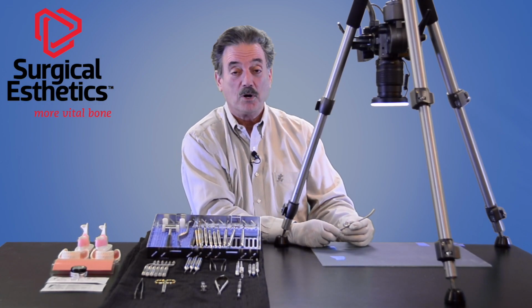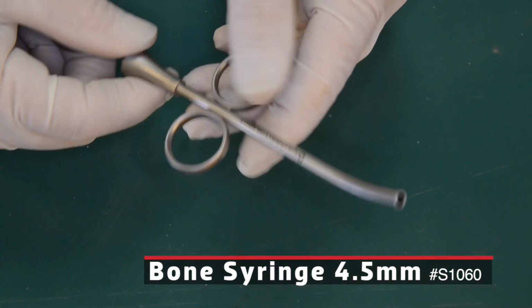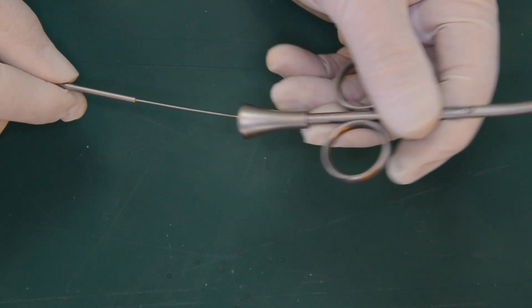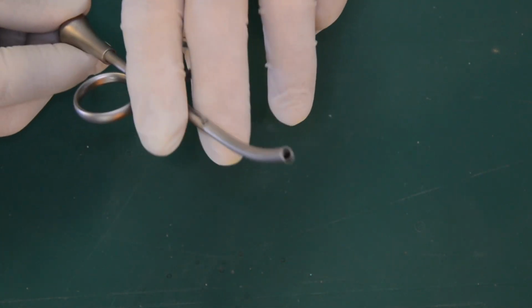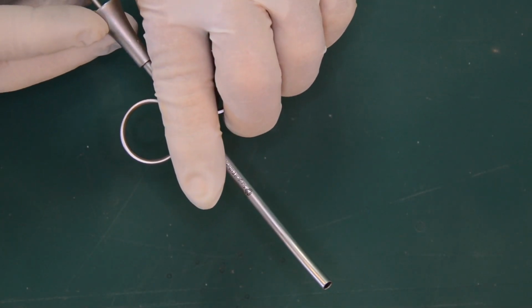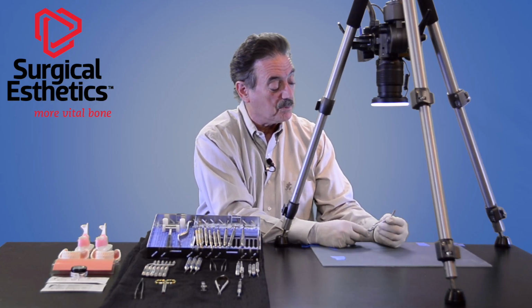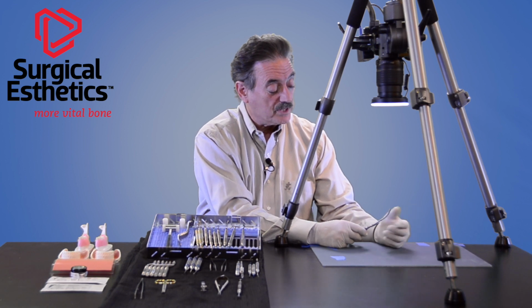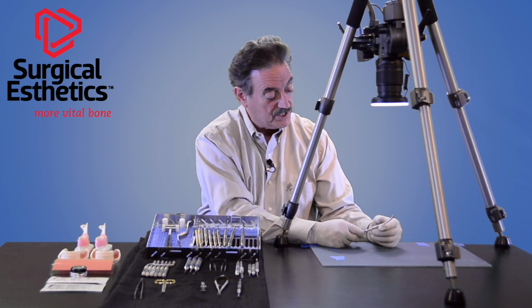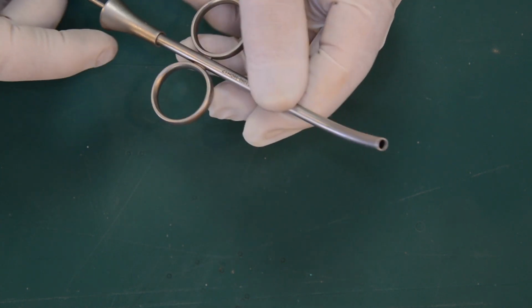Okay, the next instrument is the bone syringe. The bone syringe is really effective and works kind of like an amalgam delivery instrument, although we always load it from the tip. Never try to load it from the back end because it'll get stuck in the tube. You load it similar to an amalgam instrument, and then just use the plunger to deliver your graft material. This is really effective in an upper molar situation. A lot of times with a lower tooth, I'll simply use the mallet to deliver a large amount of material to the surgical area, but for uppers, this is a very effective instrument.